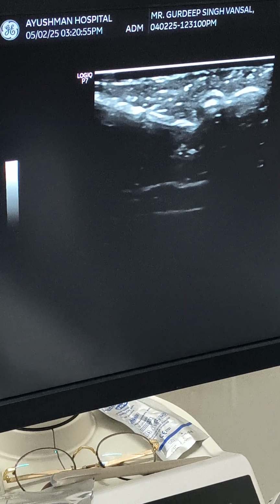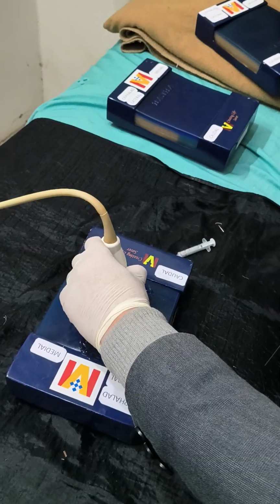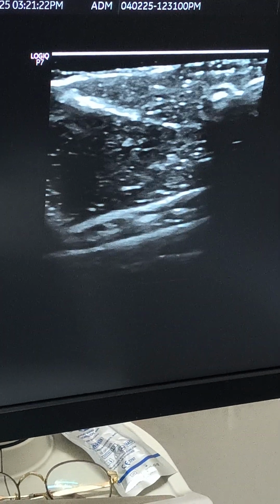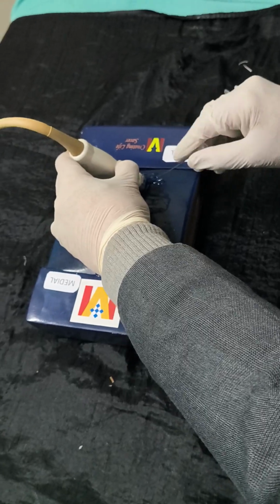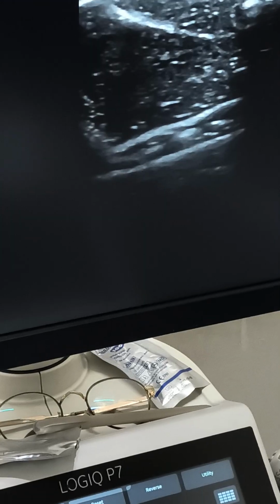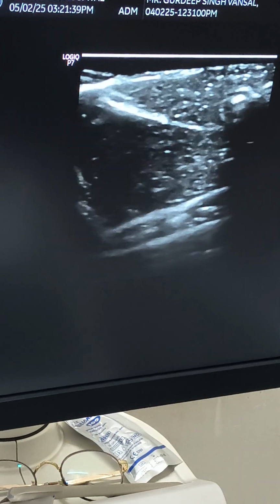Okay. So now the needle. Just see, bring the focus into the focus, the artery. Yes. Now here, this side, angle. See my angle? It is shallow. This is the angle. Okay, that's my needle. So that's what you need to practice.